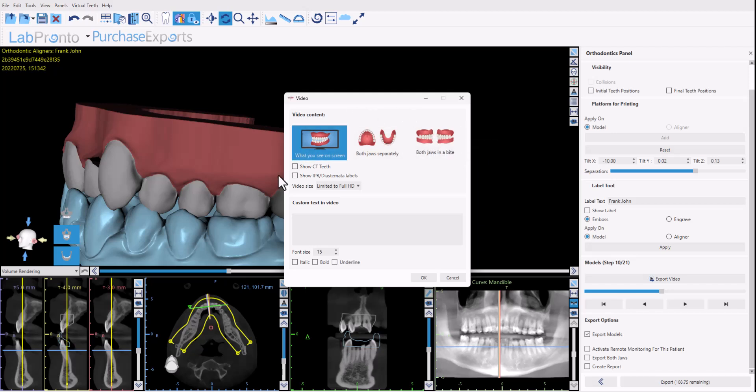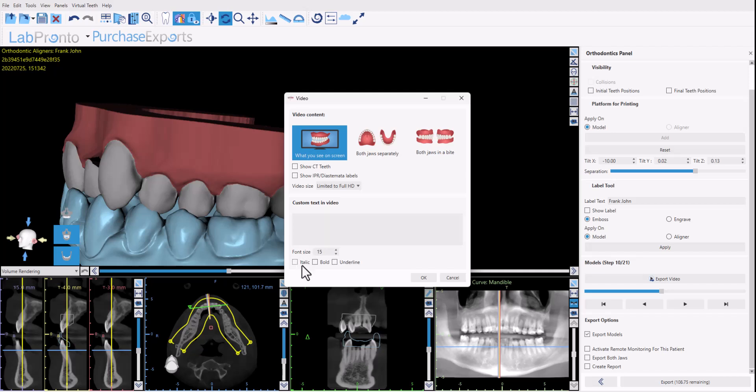You have additional checkboxes to show the CT teeth as well in the video if you've imported the CT teeth. We have the option to show or not show IPRs and diastemas. You have some video options and you could add custom text to the video with some size and font options as well. So you could go ahead and export the video. It's a great way to share the case if you'd like to and then click okay or I'm going to click cancel for right now.